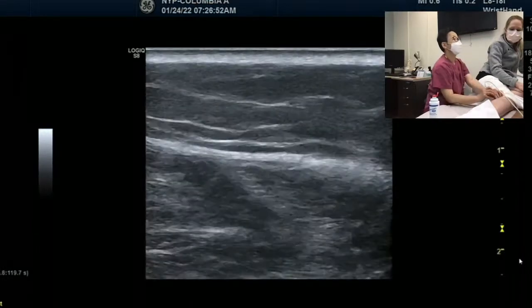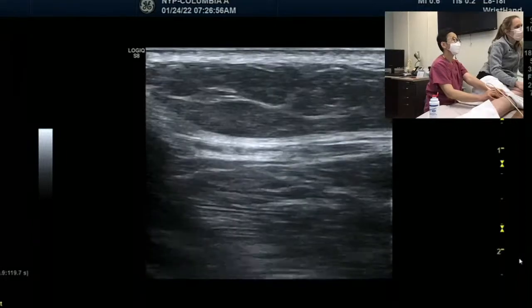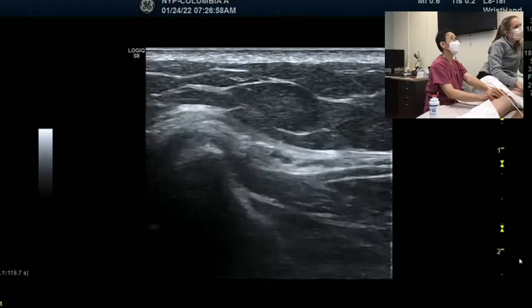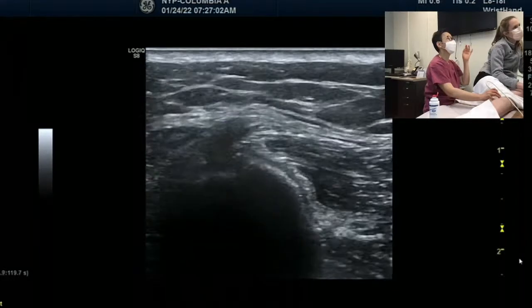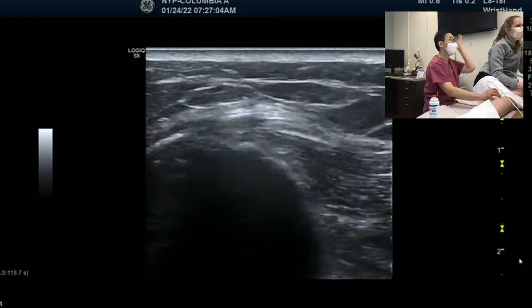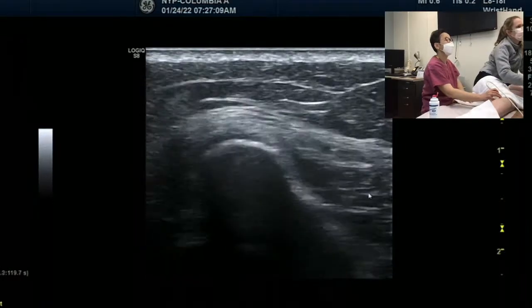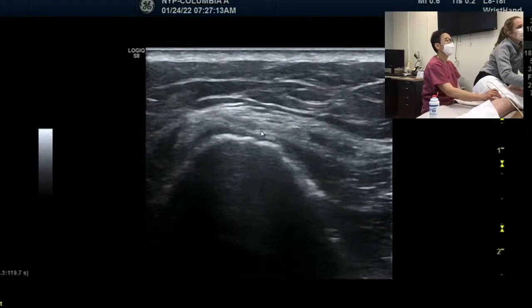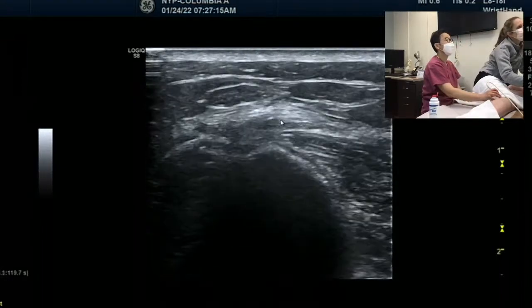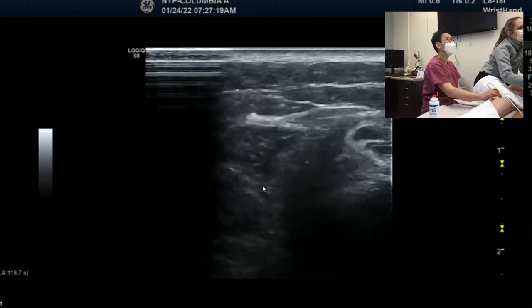Let's start from here. Here the nerve is coming, right? It's going to come up to the bone. So now it's moving. Can you guys see it moving? It's moving up to the bone, the fibula head.